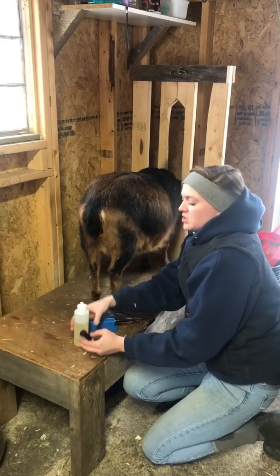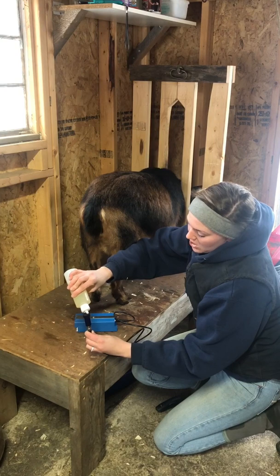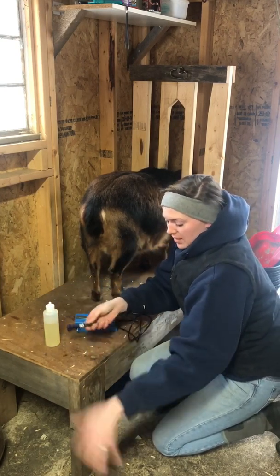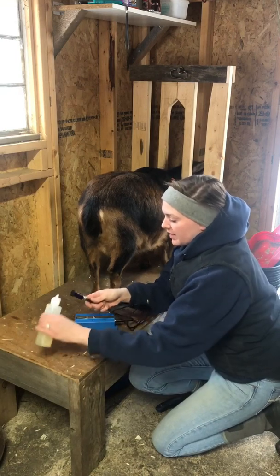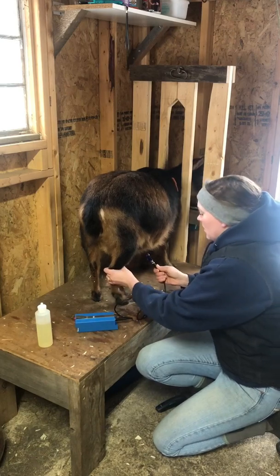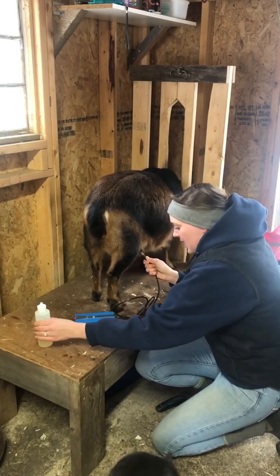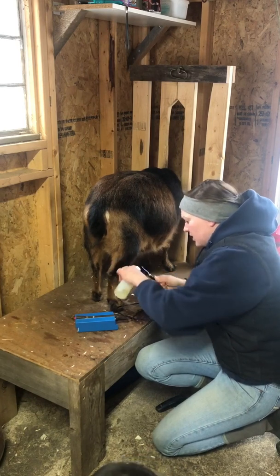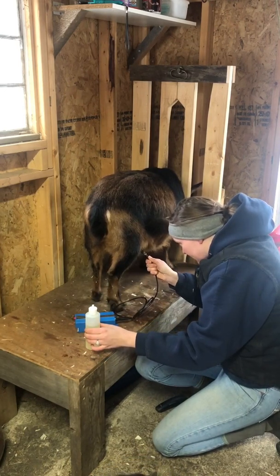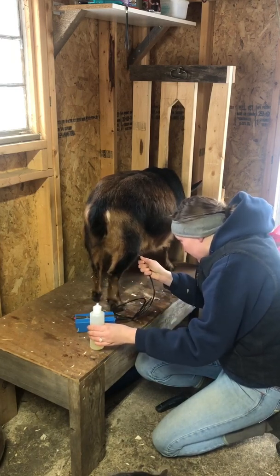The machine is on, and this is just vegetable oil — any kind of oil that will make good contact. I use vegetable oil because it's cheap and it makes a good fluid for doing this. I'm just going to start putting it on her skin, and I've found that you really need a lot of oil to make contact. So don't hesitate to really lay it on.